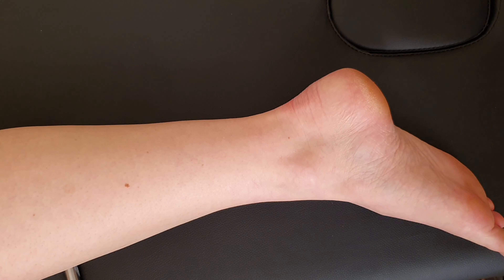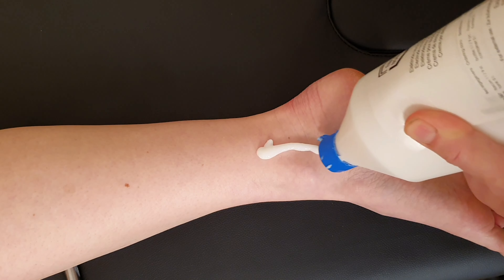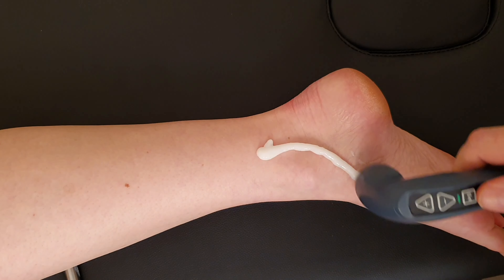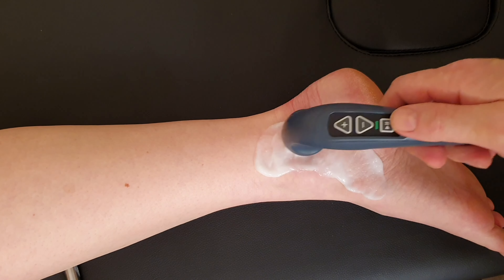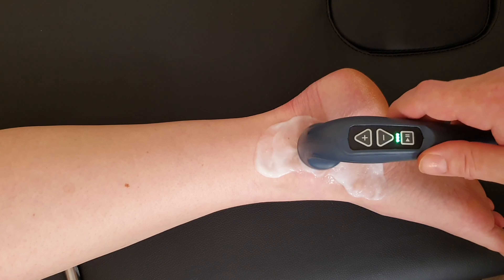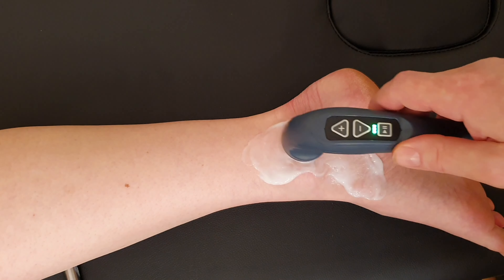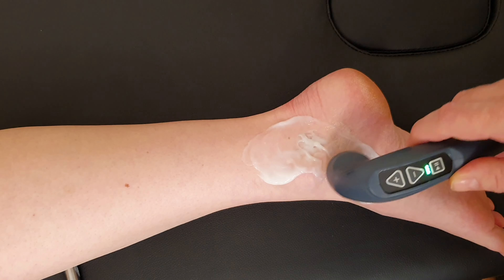I'm going to bring some contact medium in and around the tibialis posterior tendon to guide me as to where I'm going to go — to where it inserts, back around the malleolus, and up into the calf. I'm spreading the contact medium out, going around the back of the malleolus in what people might refer to as the gutter and back around. I'm using the smaller treatment head, so because of that I'm going to need more minutes to do this treatment.